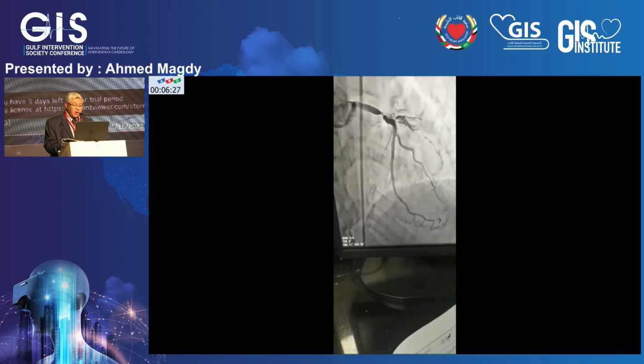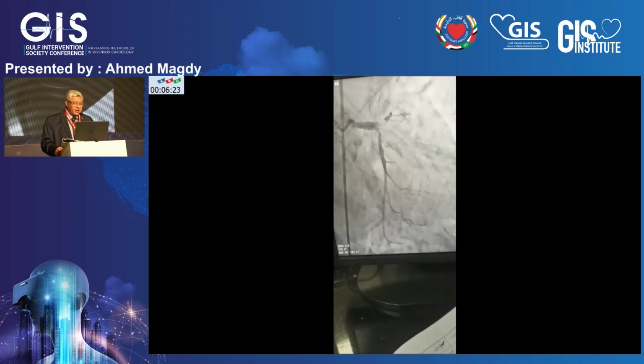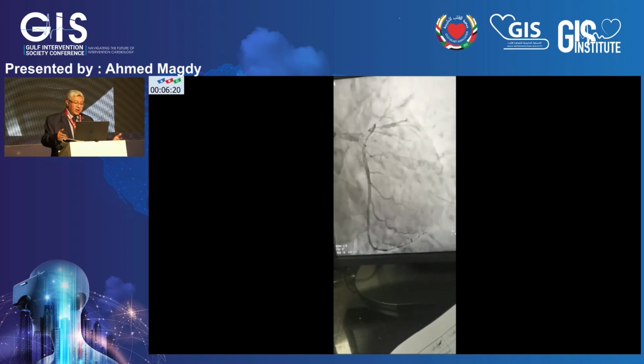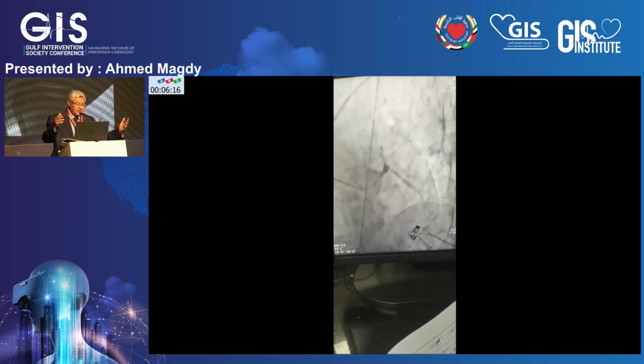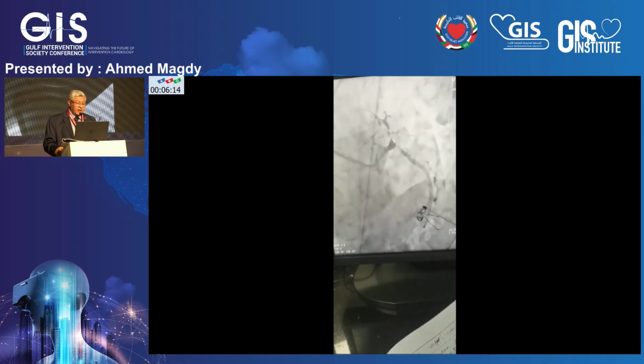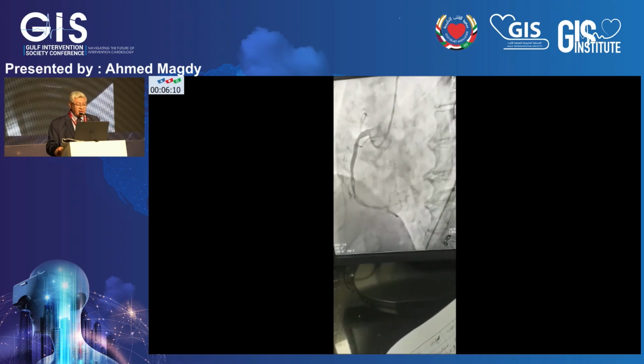This is a patient, he is Saudian, he is visiting Egypt, he is 70, he had acute chest pain, STEMI, cardiogenic shock. They did this angio for him at a certain district. There is a thrombus in the CX ostium, and there is total occlusion of the LAD.